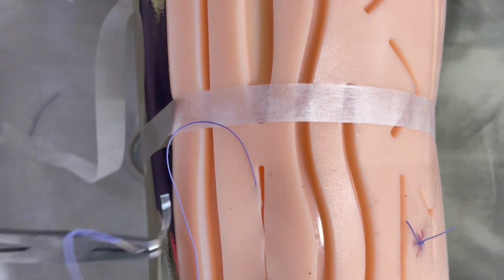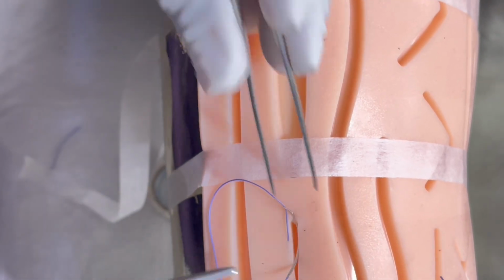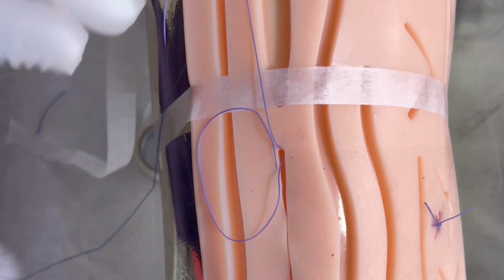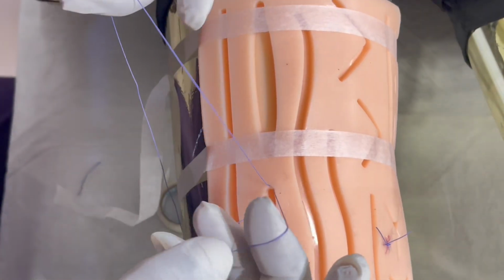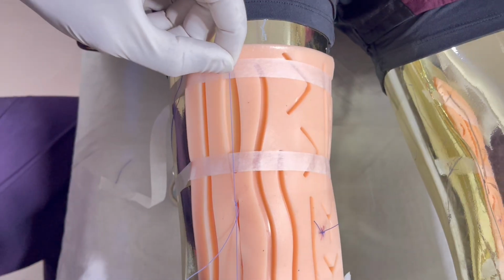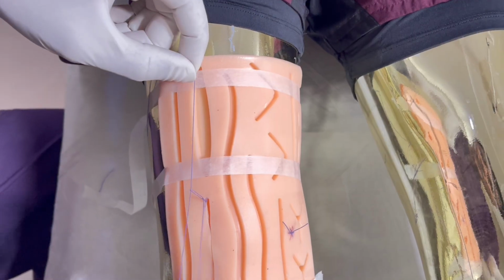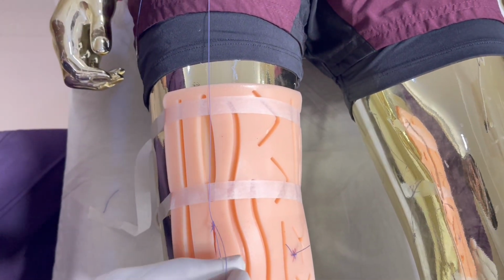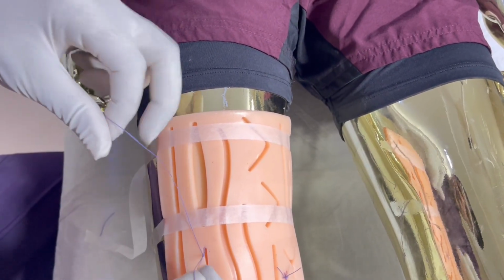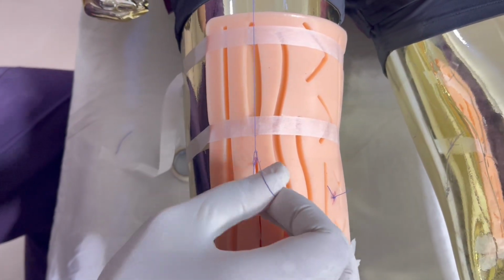So the last stitch, the end of the stitch, there can be different forms. Just you remove it, and this is called Aberdeen's knot. So what you do for this, make a loop, bring it out, then make another loop, bring it out. So this is Aberdeen's knot.